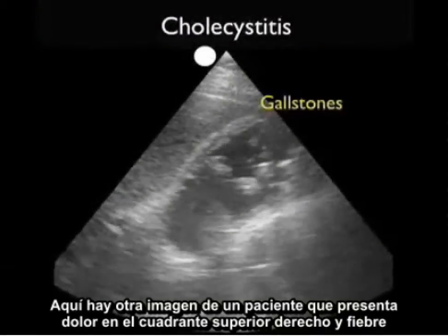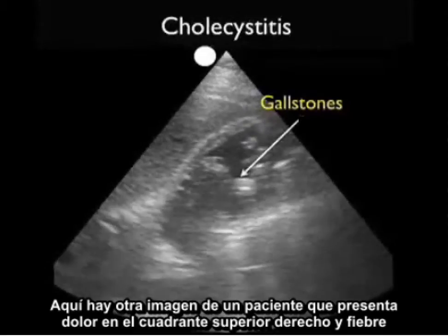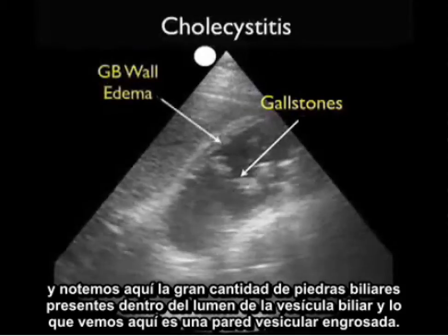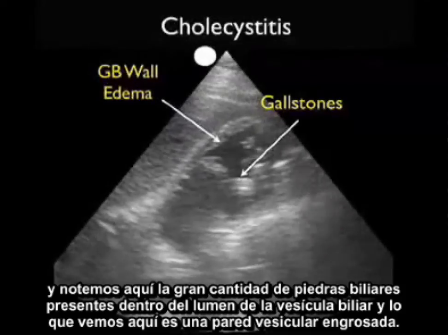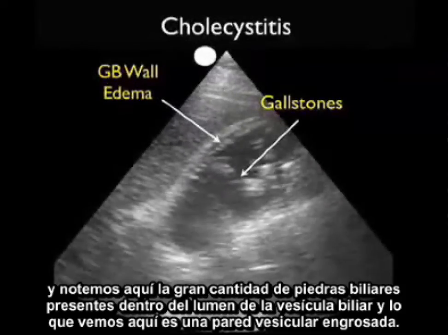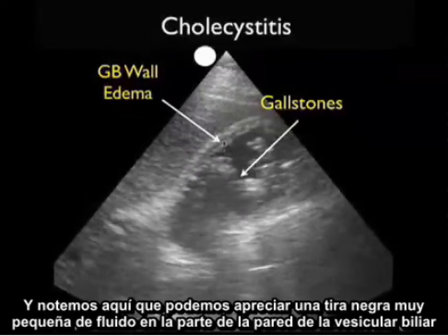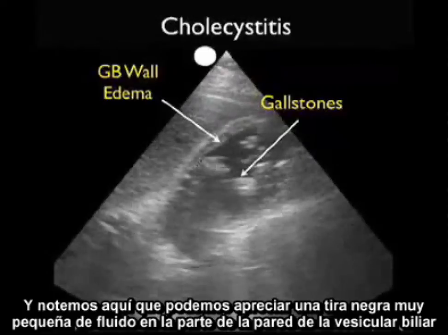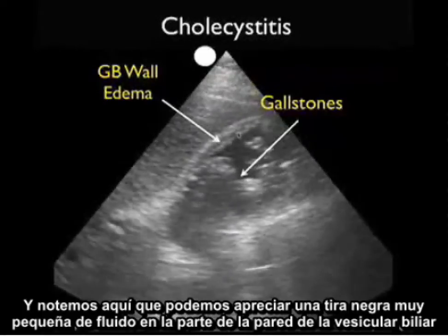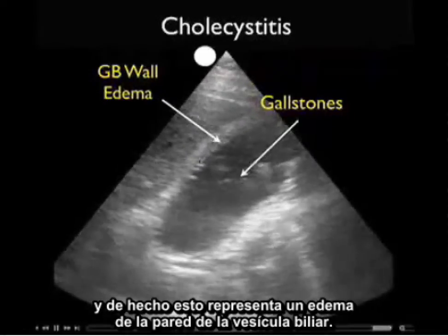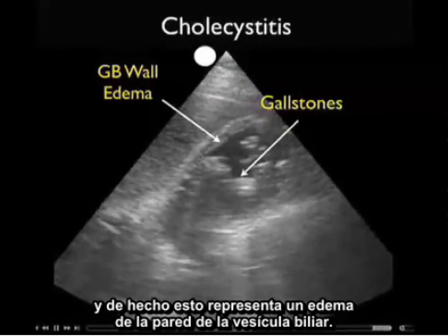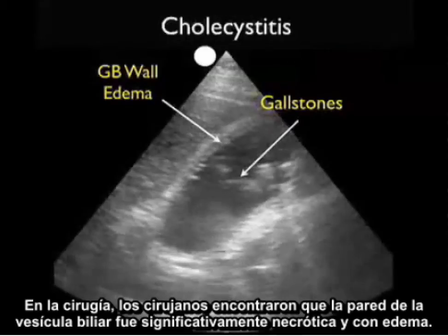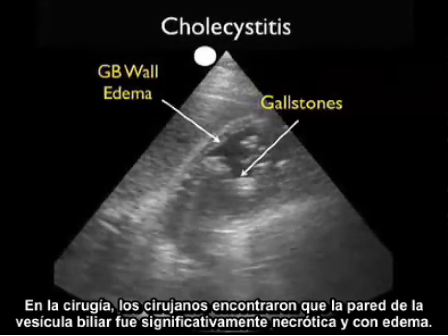Here's another image of a patient who presented with right upper quadrant pain and fever. Notice the large amount of gallstones present within the lumen of the gallbladder, and what we see here is a thickened anterior gallbladder wall. Notice here that we can appreciate a very small black stripe of fluid in the interior part of the gallbladder wall, which in fact represents gallbladder wall edema. At surgery, the surgeons found that the wall of the gallbladder was significantly necrotic and edematous.